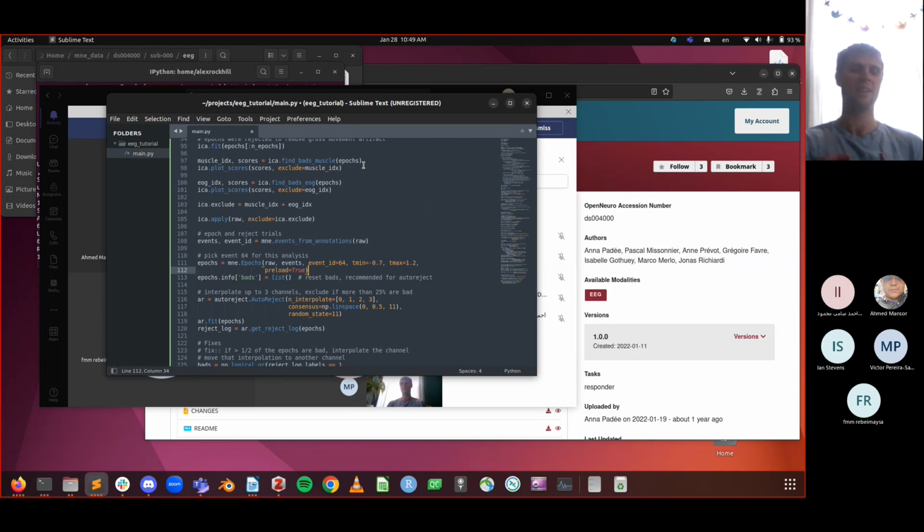In that case, it's not as essential which parts of the brain and which frequencies and what the time course looks like for those channels, as much as it is that the algorithm makes realistic speech. That's a great application of deep learning, versus if you want to know more about which time frequencies are involved in speech, perhaps you'd want to use something like classical statistics or classical machine learning to have something a little bit more interpretable.